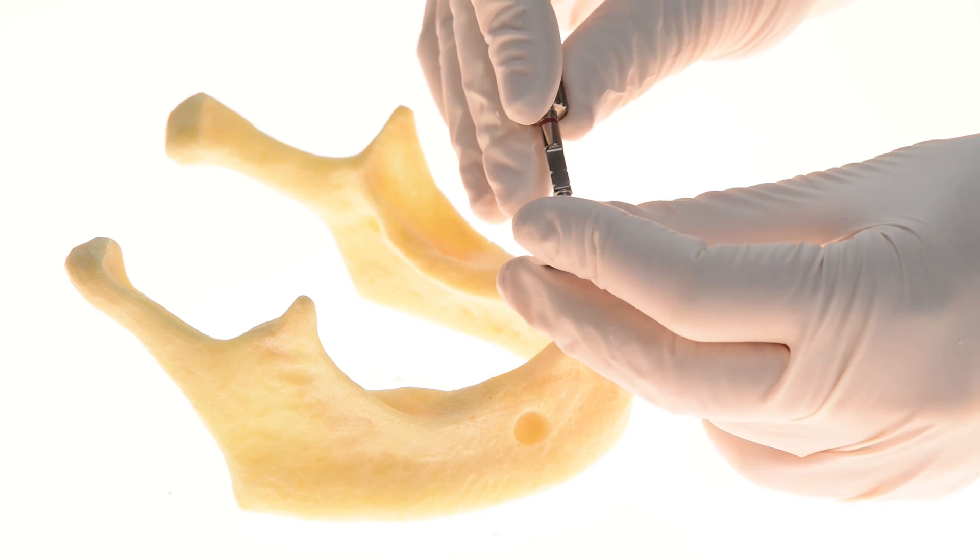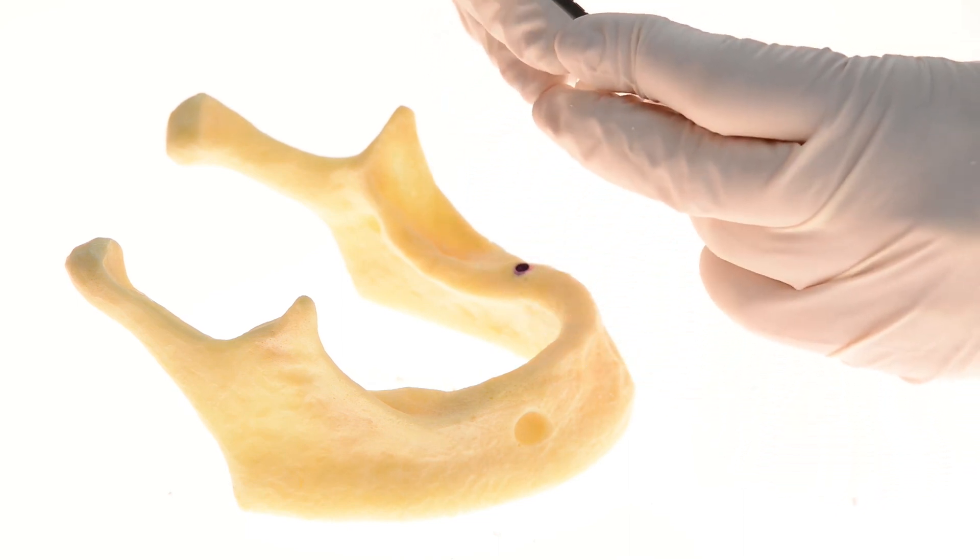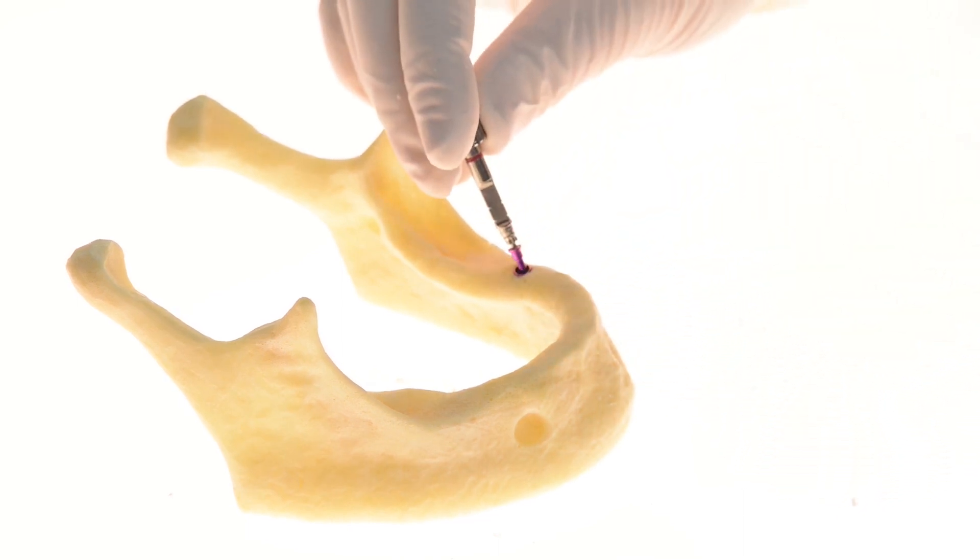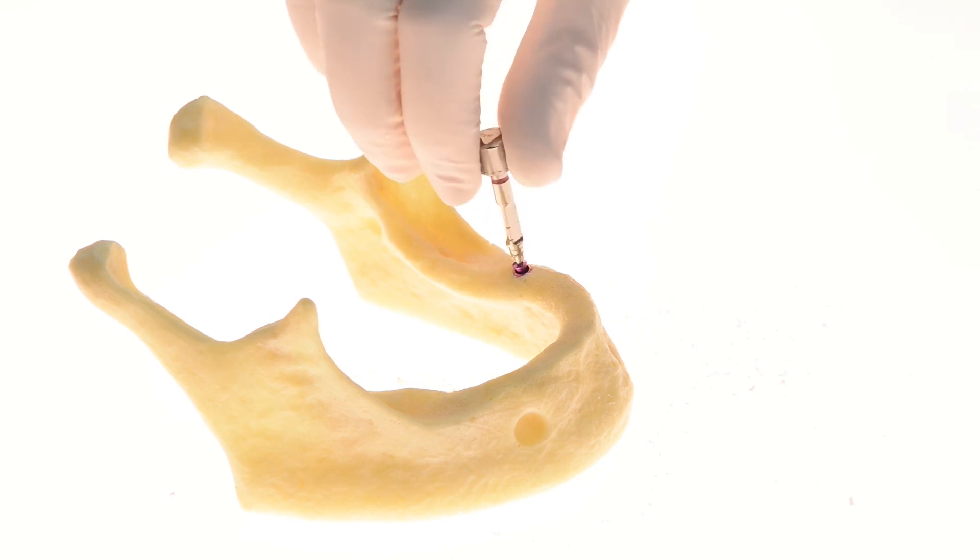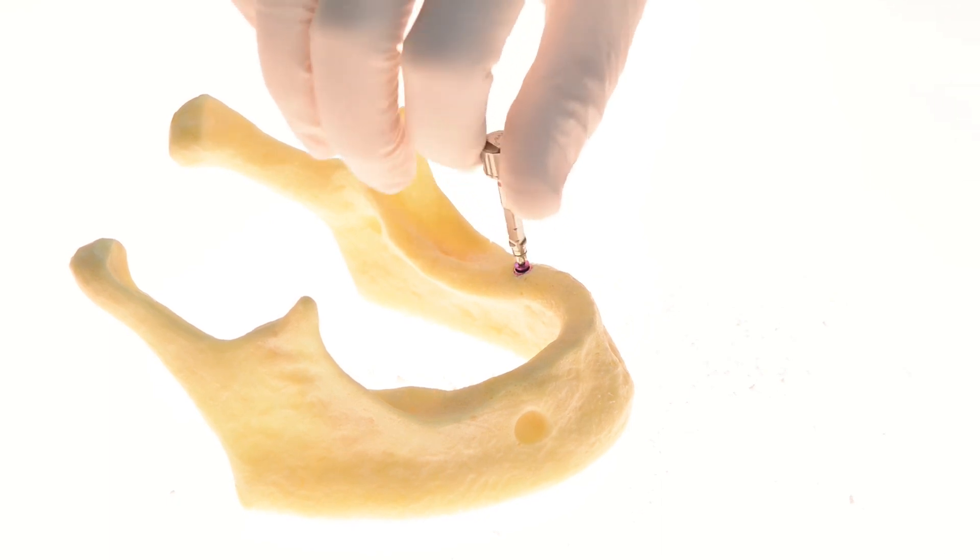After placement of the implant, use the insertion tool to remove the cover screw from the packaging and place it into the implant. Use a screwdriver to tighten the cover screw onto the implant.